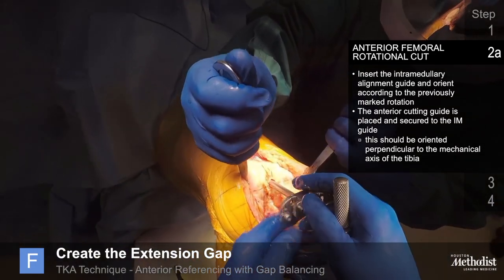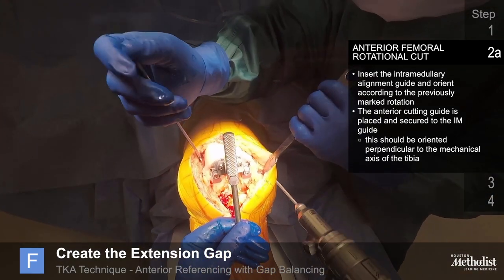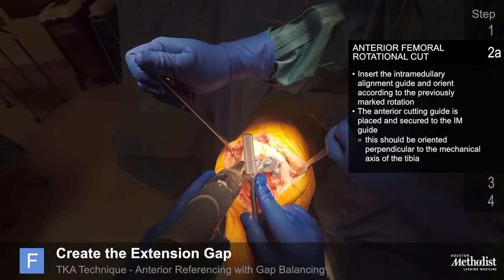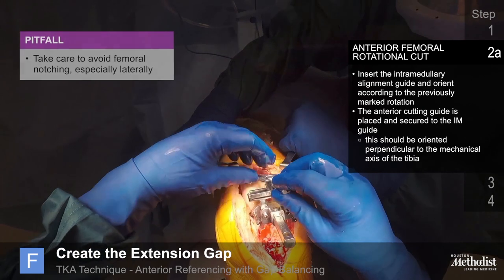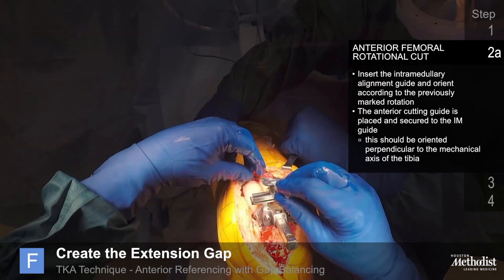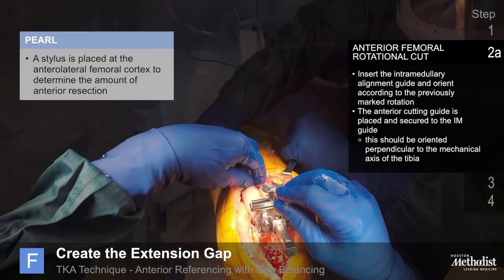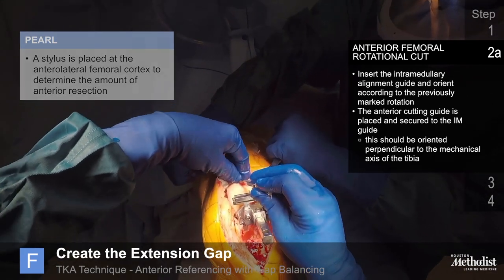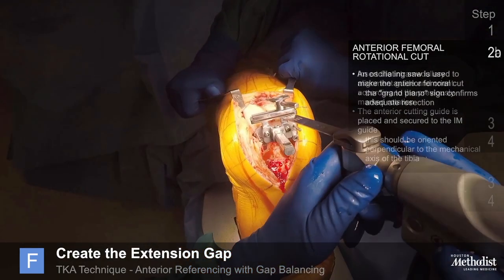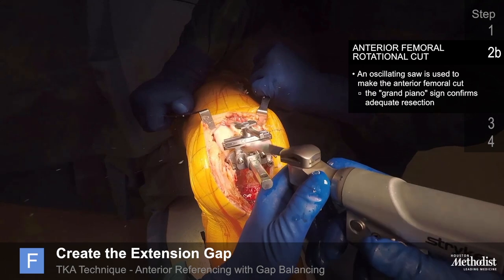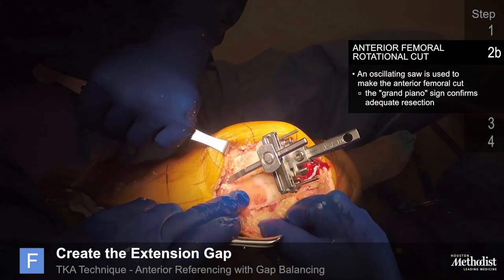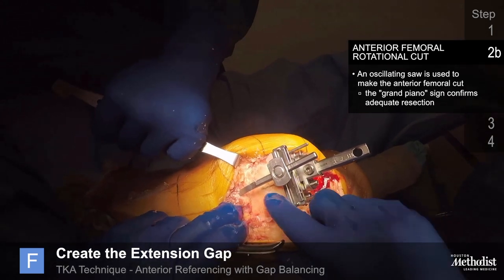Insert the intramedullary alignment guide and orient according to the previously marked rotation. This anterior femoral rotational cut should be oriented perpendicular to the mechanical axis of the tibia with the knee at 90 degrees of flexion. Because this anterior femoral cut is externally rotated with respect to the anatomy of the anterior femur, there is a tendency to notch laterally and take excess lateral bone. It is best to place the anterior stylus on the anterolateral femoral cortex to avoid notching laterally. The anterior cutting guide is placed and secured to the IM guide, then an oscillating saw is used to make the anterior femoral cut. The grand piano sign — where the resulting cancellous bone pattern is longer laterally than medially — confirms adequate resection.